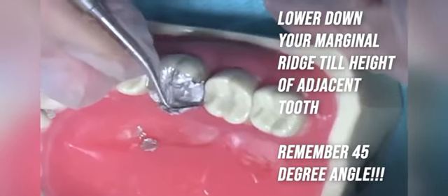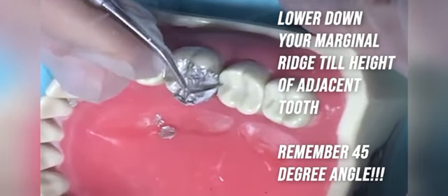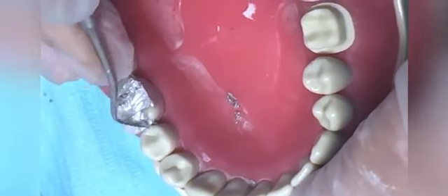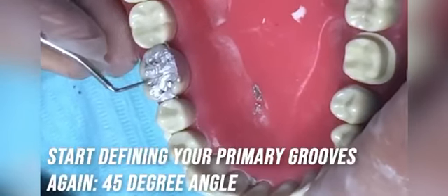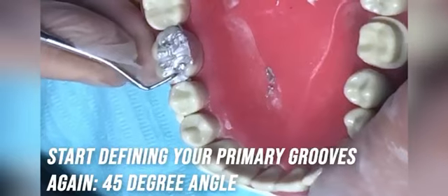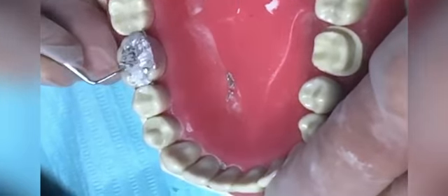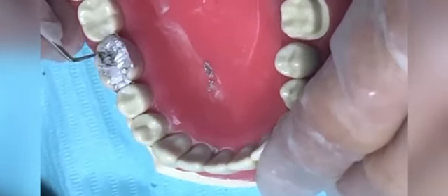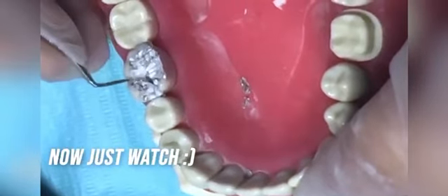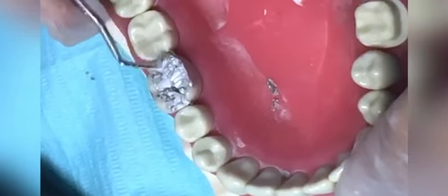Now on the distal side, we are going to create the distal cusp. Just remember, the criteria is about matching the marginal ridge height. Distally, you will get the distal cusp tip, which will always be a little bit high. While you are doing the mesial part, you need to create the mesial triangular fossa, so keep that in mind. And mesially, you will get the V-shaped area when you see from the side. So try to create that V-shaped part on the mesial side in the contact area. The contact will be a little bit more buccal on the mesial part.